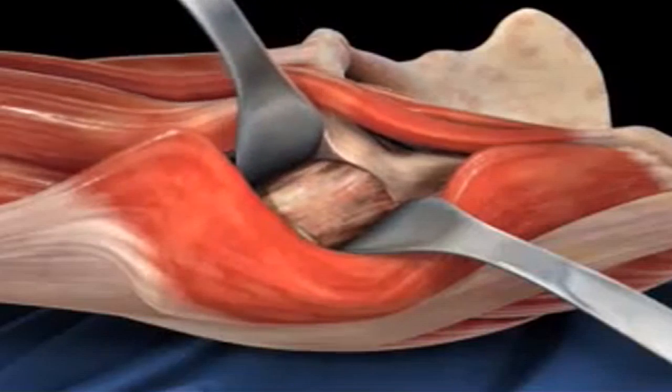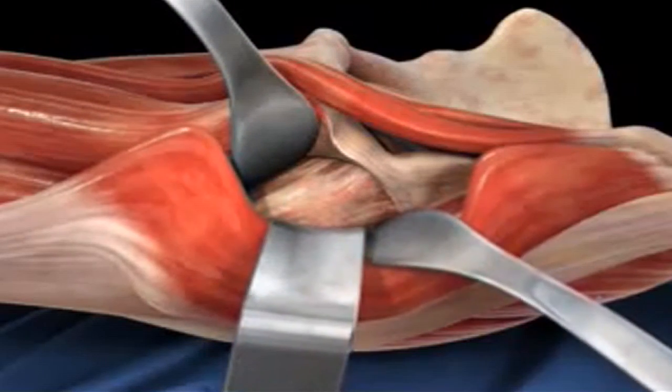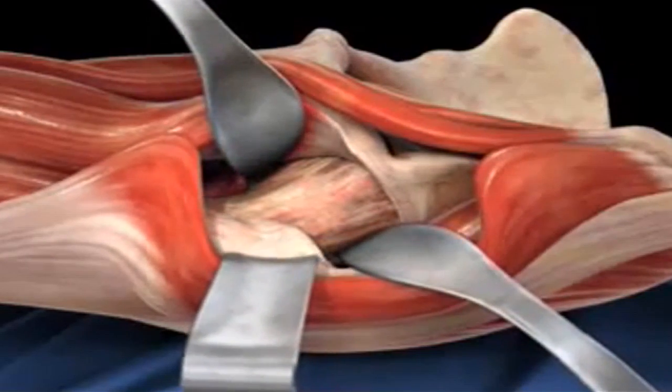You do not remove any muscles or tendons off of the bone, so you're basically separating and pushing muscles apart as opposed to cutting and splitting them. That procedure done correctly dramatically improved pain control and recovery times compared to standard hip replacements.